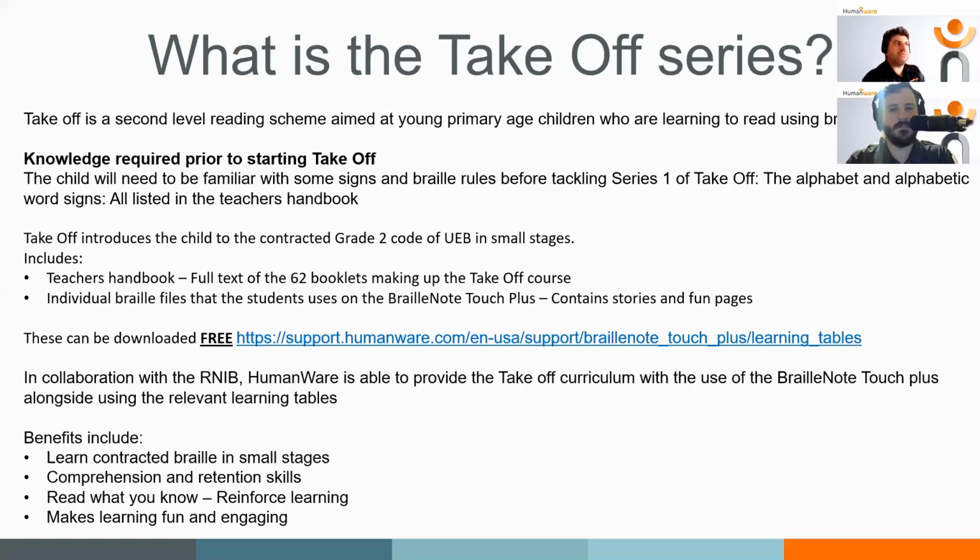So the resources that are available to you from HumanWare's website under the support page include the teacher's handbook. This is the full text of the 62 booklets making up the Takeoff course. And you'll get the individual Braille files that the students will use with their BrailleNote Touch Plus. All these Braille files contain the stories and, of course, fun pages.